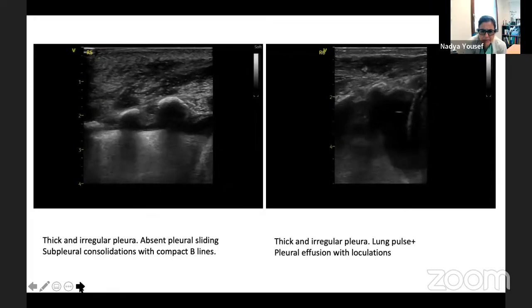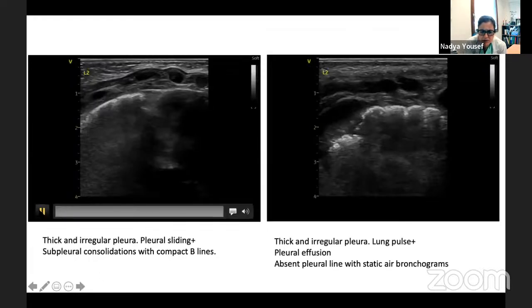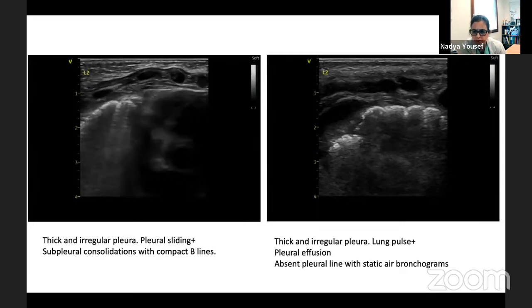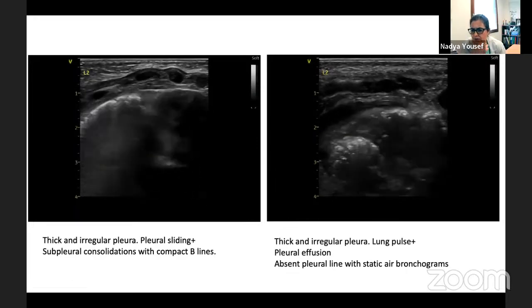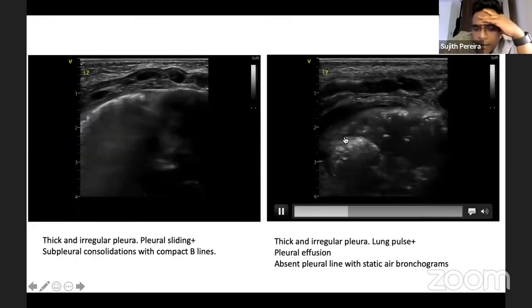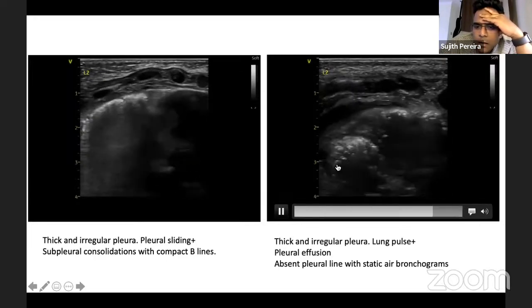I had a bit of a problem understanding what we were seeing. Was it this one? Yeah, I think L2 probably. Of course, you've got the heart taking up a big place in L1, but the L2, I think. L2, yeah. I'm unsure about exactly where we are and what the thing on the left is. You think it's the lung or it's? I think that is the lung. No, I think that is the lung, Nadya.